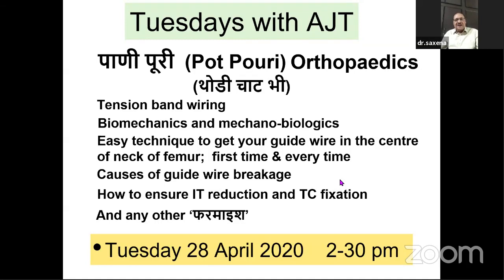Now, as far as the dynamization is concerned, as you also said, the very principle of the Ilizarov is distraction osteosynthesis, because he used this particular fixator for lengthening of the bone. And there he realized that when you distract the bone, it has a capacity to form more bone. But there he insisted on the continuity of the periosteum. And therefore, as you suggested, incomplete corticotomy, keeping the periosteal tube intact by doing the last part of the quarter circumference by osteoclasis, all that is very important.